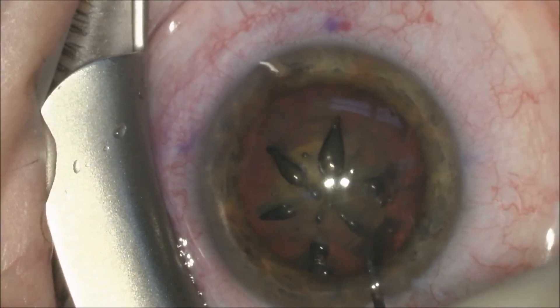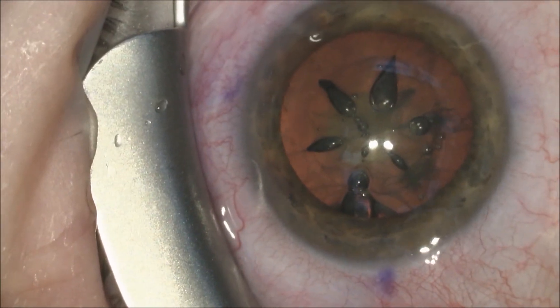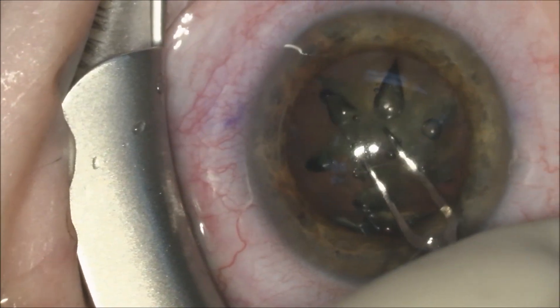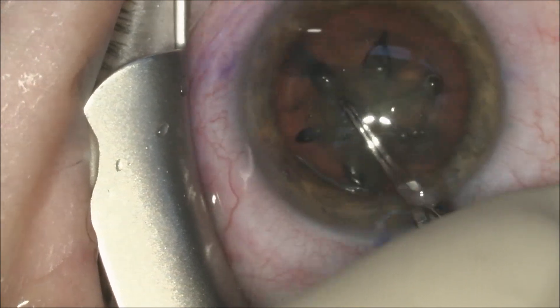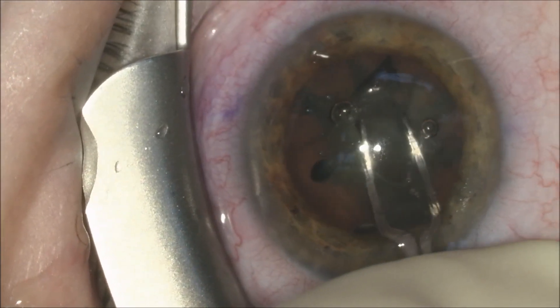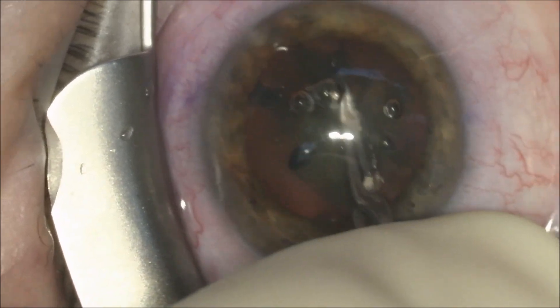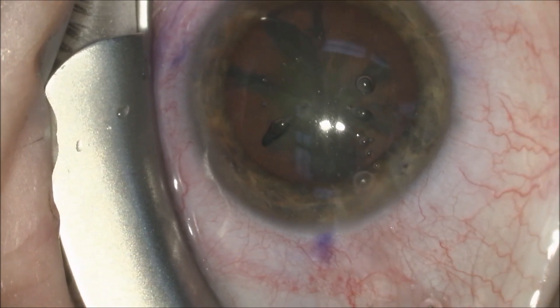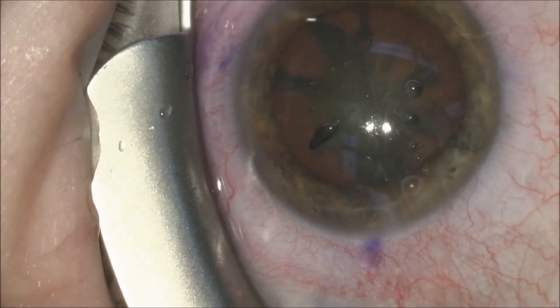We perform hydrodissection in the normal manner and make sure that we can turn the nucleus. We will use the pre-placed laser fragmentation incisions and complete them with an Akahoshi pre-chopper to make sure the previously made fragments are completely separated.